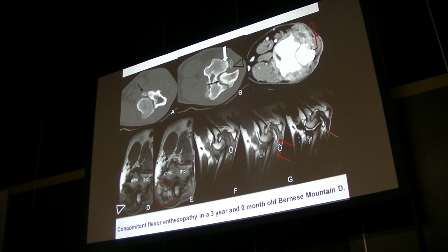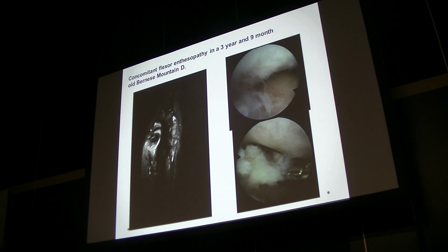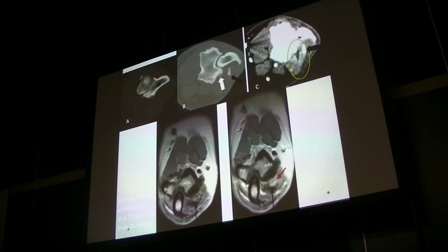So that's a hugely inflamed joint, having a large fragment, so probably we would treat both affections in this case. This is a STIR image showing the huge enhancement. It's not enhancement in this sequence, it's really hyperintensity of inflamed aspect. And here the appearance of the villi, where the joint capsule is ruptured, and where we pick up the inflamed fibers of the attachment. And this is the fragment at the level of the medial coronoid process being removed by a grasping forceps.